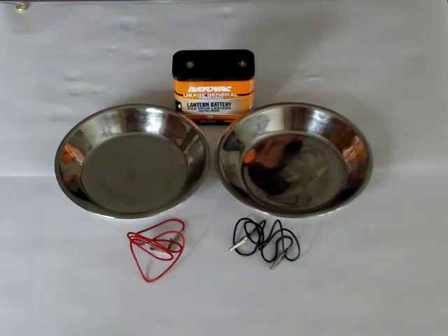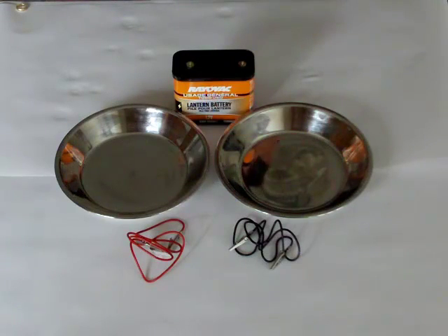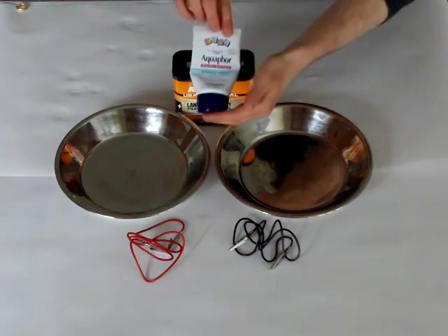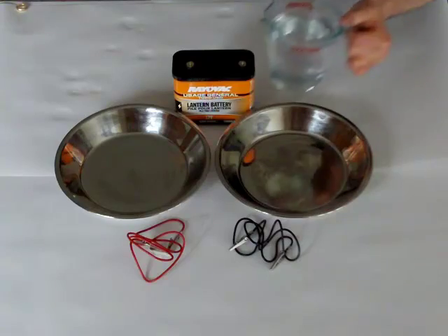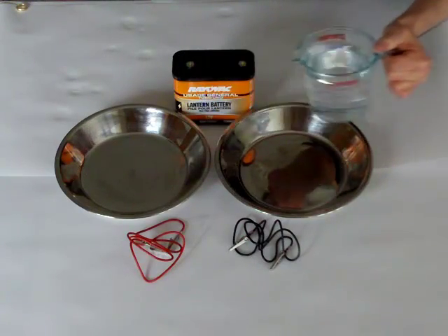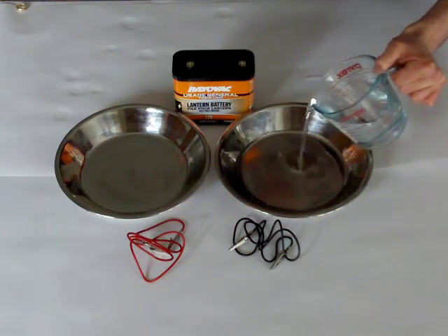The first time you do this, you shouldn't add salt — but for this demonstration, I'm going to. It helps conduct the current a little better through your skin. We're also going to use Aquaphor, which will help with any irritation during the treatment. Now I'm going to grab a big scoop of water in my 2-cup Pyrex measuring cup. Don't bring your pans to the water — bring the water to the pans. You don't want to fill the pans all the way to the top, just enough to submerge your palms. Two cups should do it.